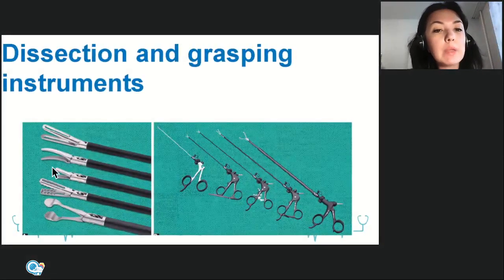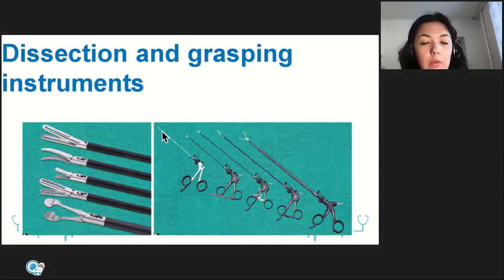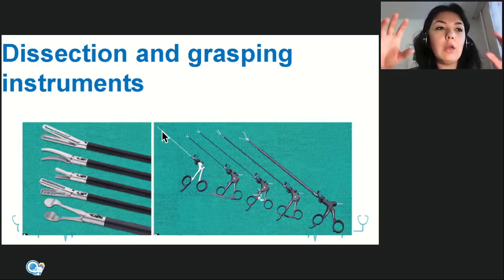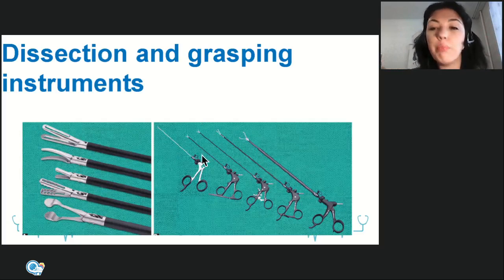Okay, and here you can see instruments. We saw some of them, I think, at our museum. What is the main difference from normal instruments? They are long and narrow, and the longer the instrument is, the harder it is to use, because our hand and the end of the instrument are very far from each other, and to reach the balance is much more complicated. Again, they are very expensive. The price of one instrument starts from about 20,000 rubles, and then it increases depending on the brand, the manufacturer of the instrument.